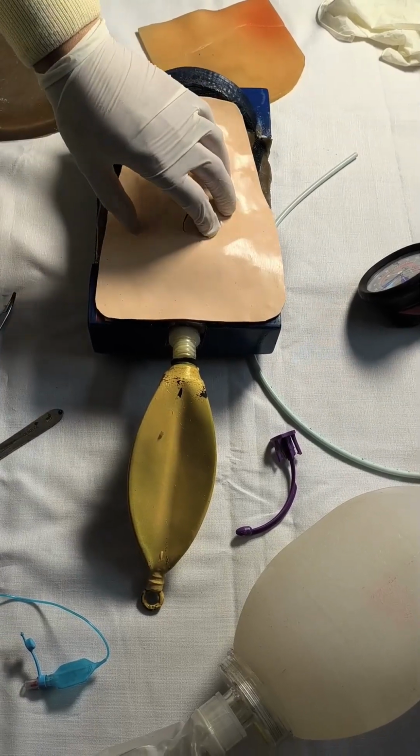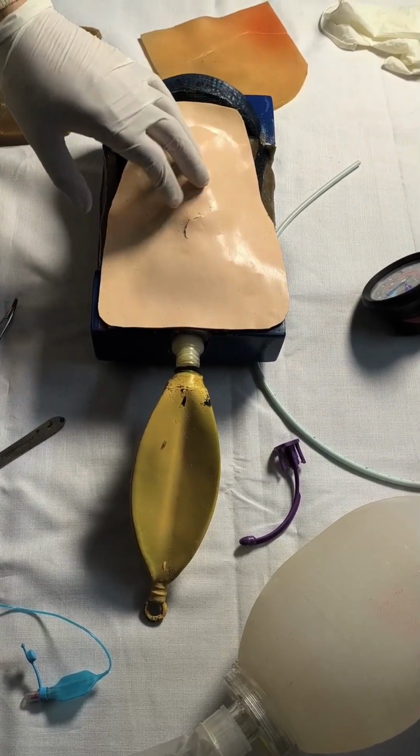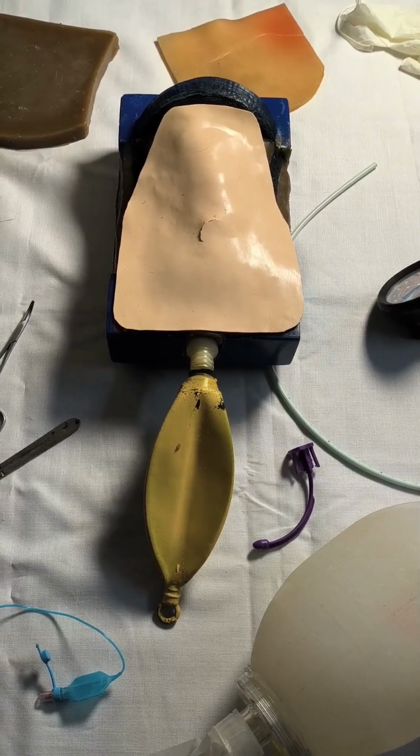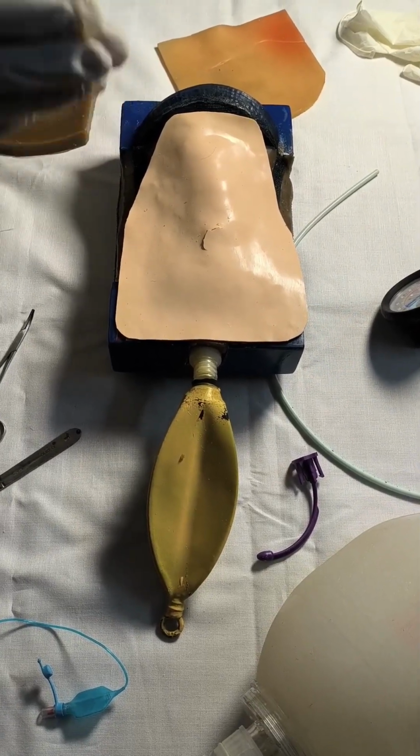So please go for this mini model, and please do deliberate practices by mental visualization and by doing the actual procedure. Thank you again for your time.